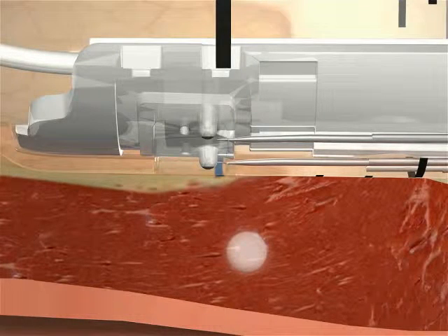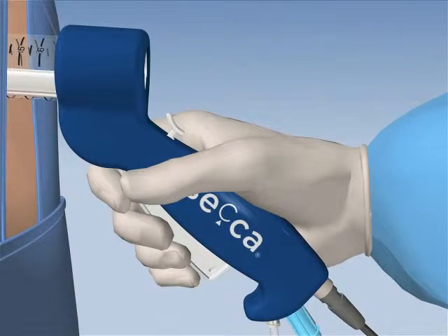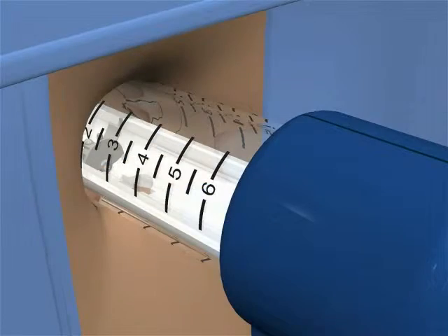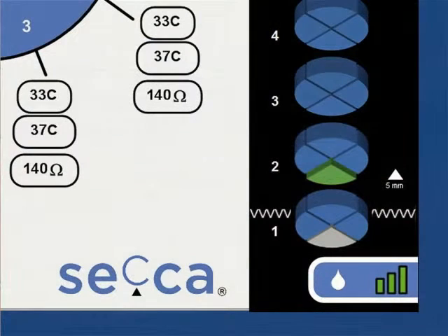Moving or attempting to move a SACA handpiece with the needles extended may result in unintended tissue damage. Needle retraction is accomplished by depressing the thumb-controlled needle release button on the handle. Advance the SACA handpiece 5 millimeters to the next treatment level. Note that the arrow on the screen directs you to the next treatment location. Untreated quadrants are indicated in blue. A green segment indicates the target site to be treated next, and it stays green during a 60-second treatment cycle. Completed or manually skipped treatment sites are indicated in gray.